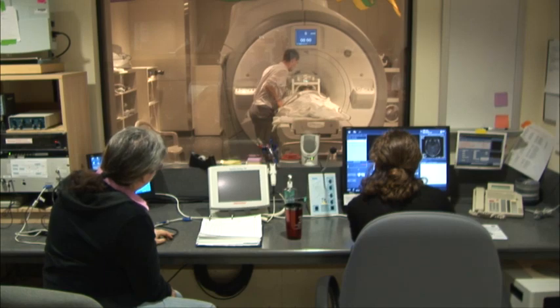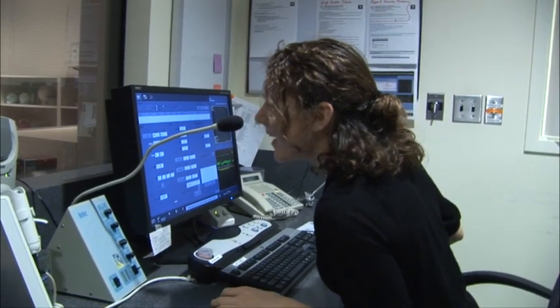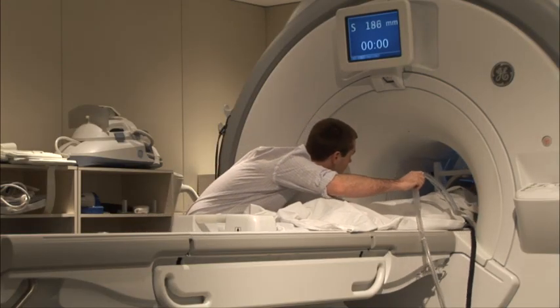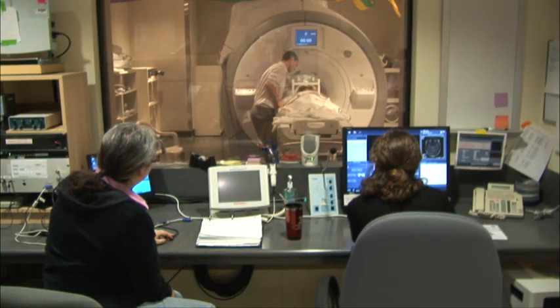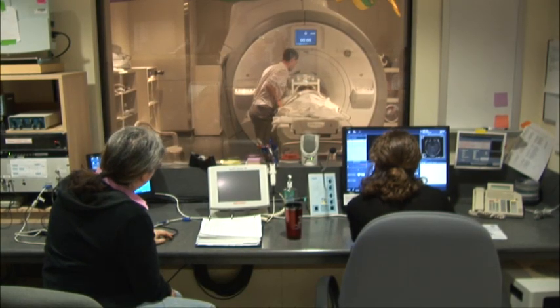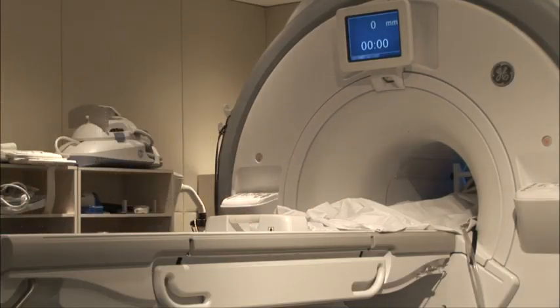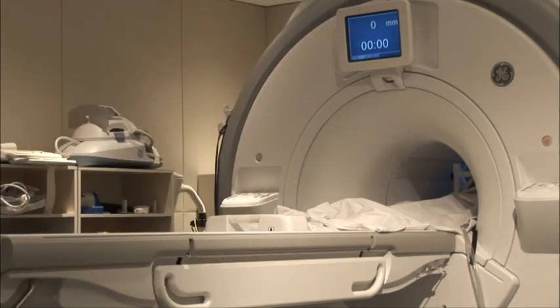We'll be in the room next door watching you through the window and making sure you are fine. We will even be able to talk with you through the speaker that's built into the scanner, so it will be just as if we were in there with you. We'll check with you to make sure that you can see everything clearly in the mirror above your head before we start taking pictures of your brain. Again, the scanner will make funny noises but you already know that. So just relax and keep still.